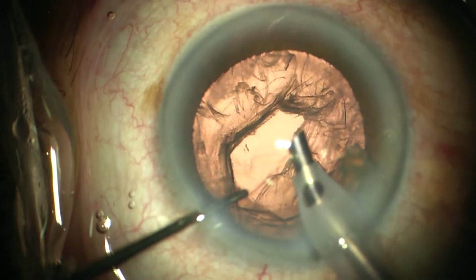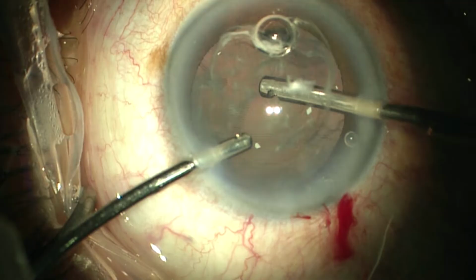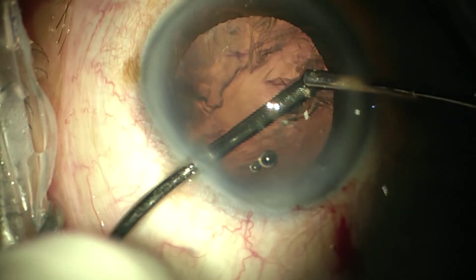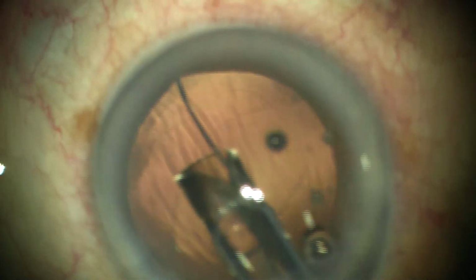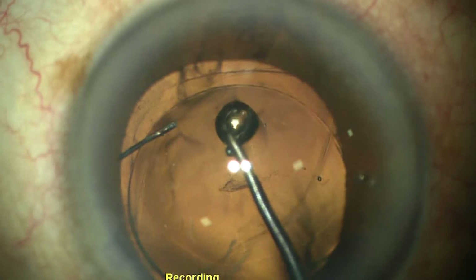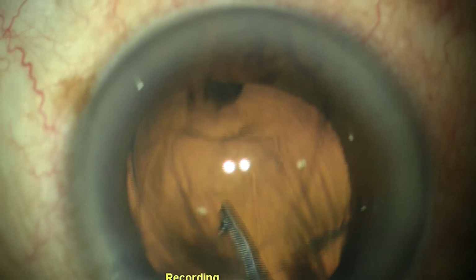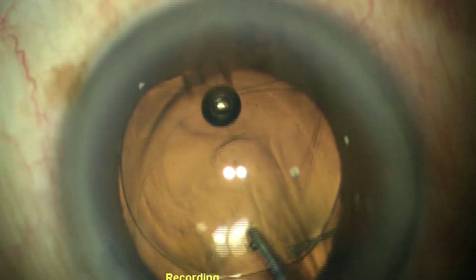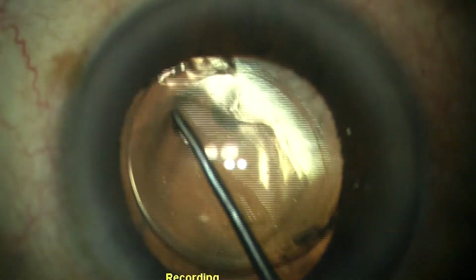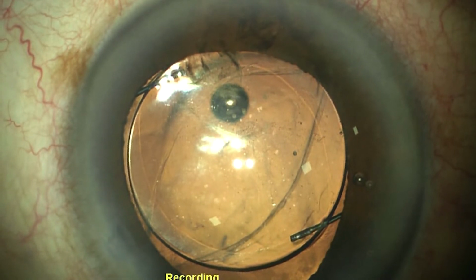Again, keeping the anterior chamber maintainer, introducing Viscoat into the anterior chamber and doing an anterior vitrectomy, and then removing the cortex and the epinucleus and putting a multi-piece lens in the sulcus and capturing the optic of the lens into the capsulorhexis margin. This is called the optic capture, which ensures a long-term stability of the lens and also prevents UGH syndrome, since the IOL is located actually in the bag, the haptics in the sulcus.